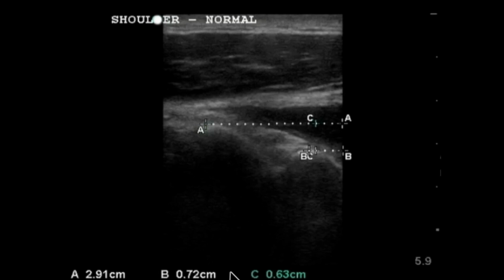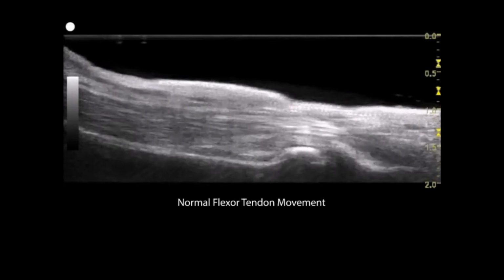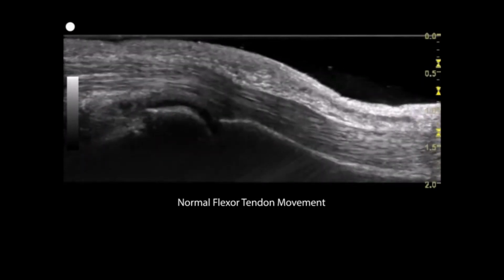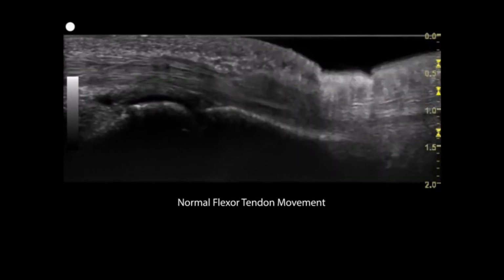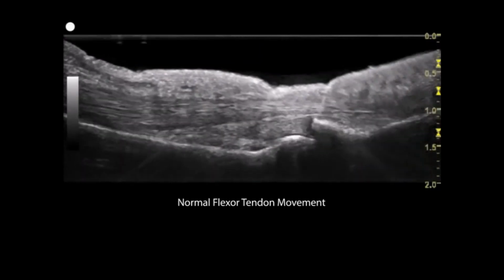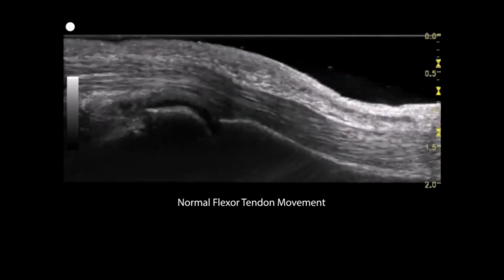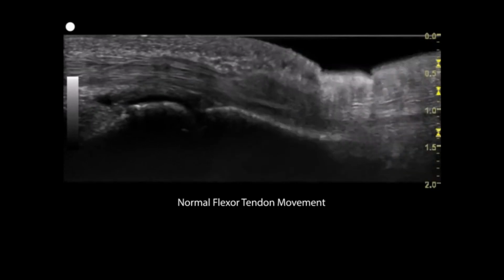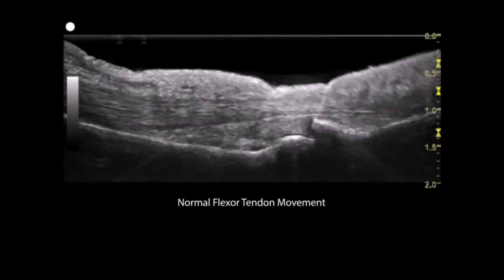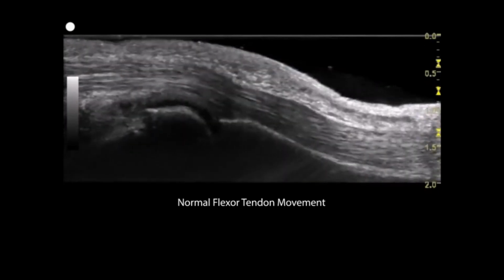If a persistently retracted tendon is noted on ultrasonography when a joint is taken through a normal range of motion, this suggests a complete tendon tear. Partial tendon tears do not retract. If a tendon retracts away from the joint cavity when you go through a normal range of motion, this suggests a complete tendon rupture. Such injuries mandate joint immobilization and orthopedic follow-up.